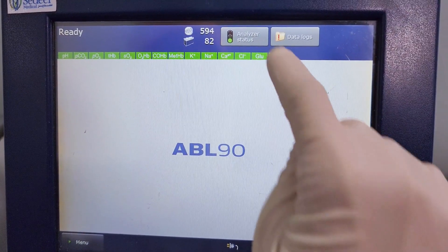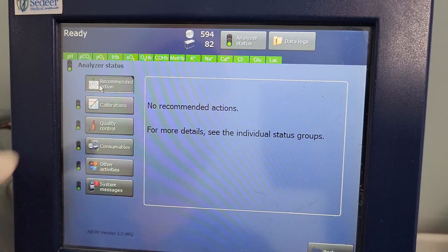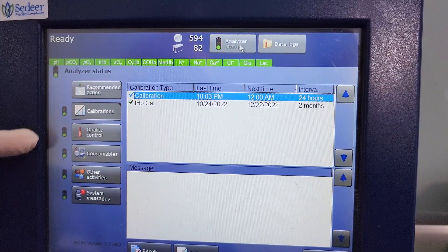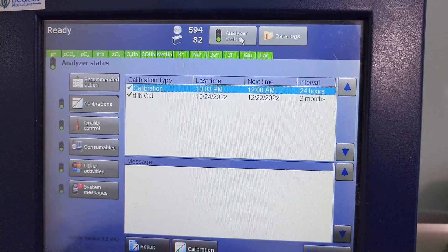To access the analyzer status screen, tap analyzer status and check the recommended actions. If the color is green, no action is required. If it's yellow or red, one or more actions are required.